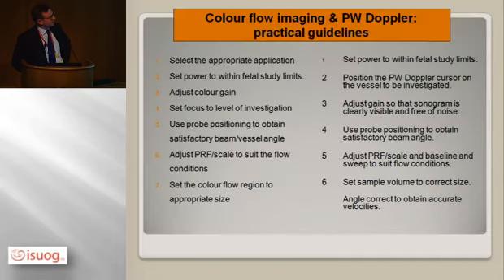So I will leave you with a few of the basic key points that we've talked about. I don't think you'll need to write them down because they are pretty straightforward and simple, and they're on all the buttons on the machines that you use every day anyway. But I'm just simply going to ask you possibly to look at them again, and those of you that don't, try using them and optimize your images using them.